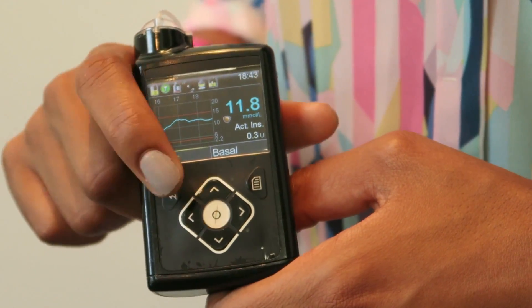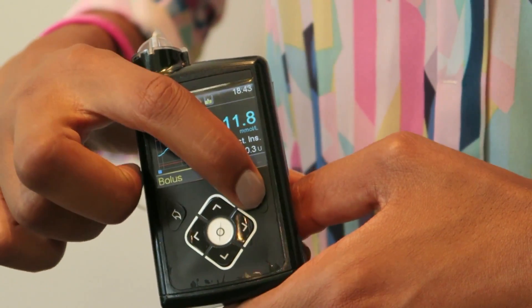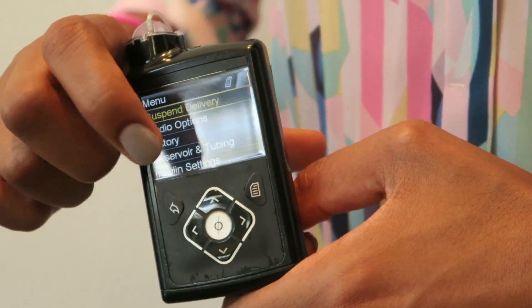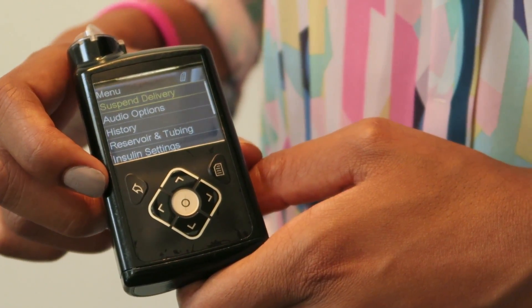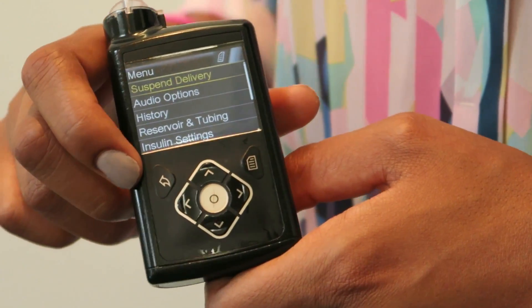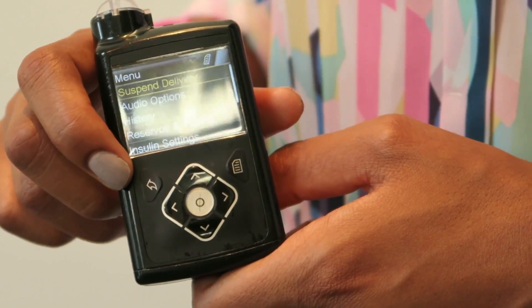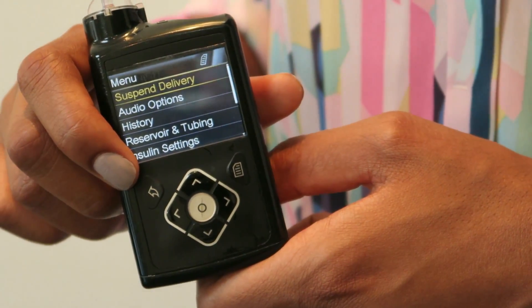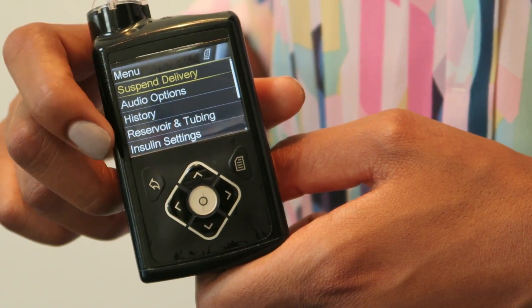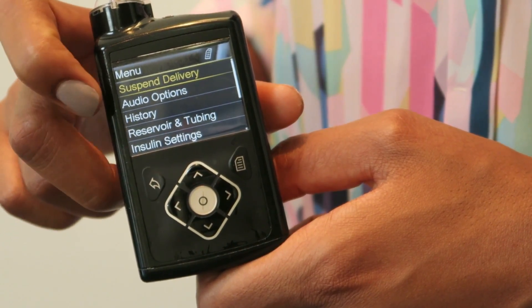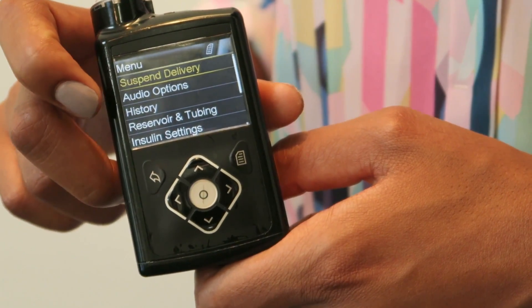To get to the main menu you press this button here. Our first option is suspend delivery — if you needed to stop the insulin delivery for any reason, that's the option you'd press.